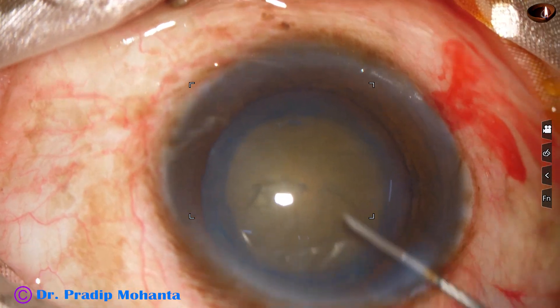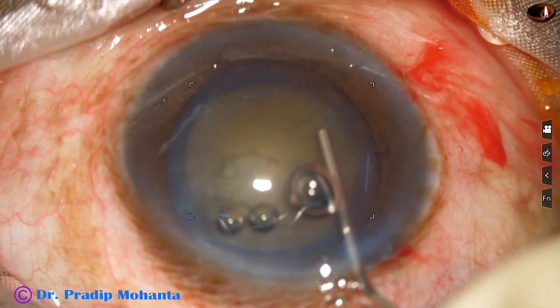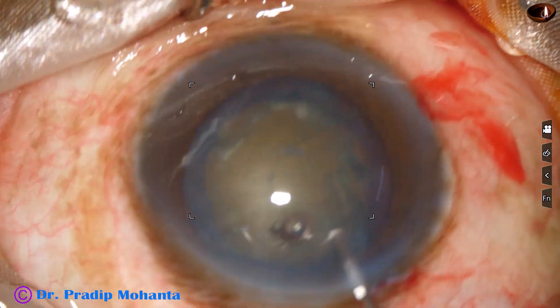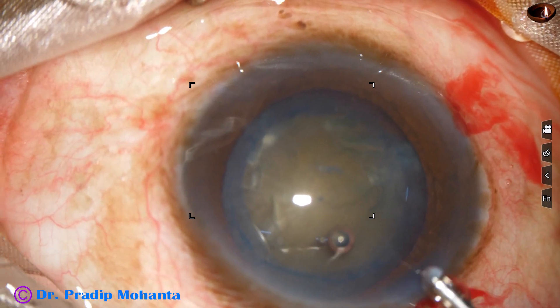And now hydrodissection is done. In this case when I did capsulorhexis there was no wrinkling of the anterior capsule, which indicates that the zonule is quite healthy in this case.